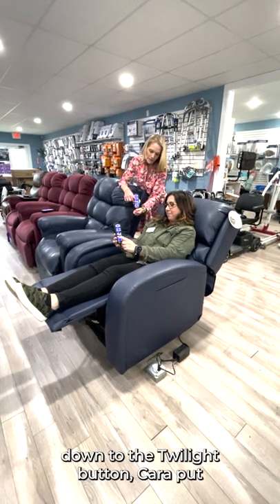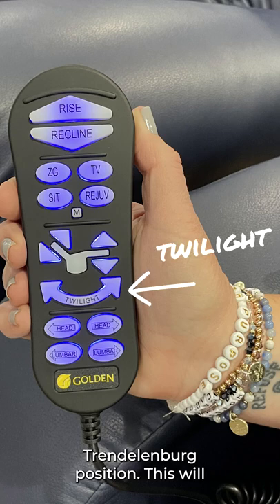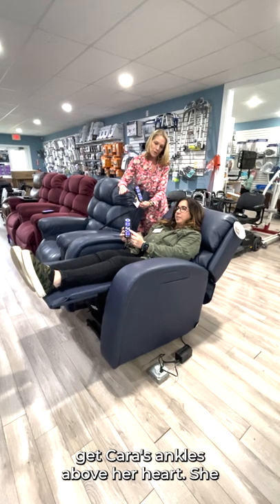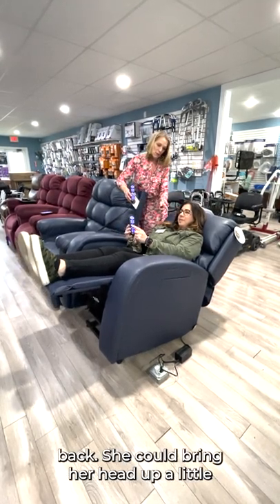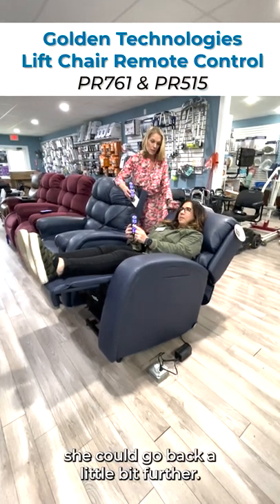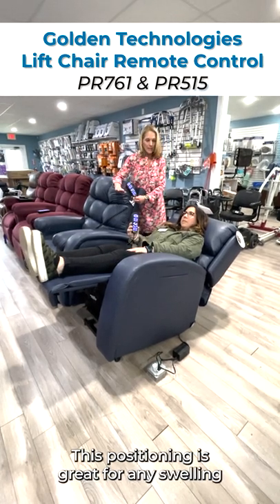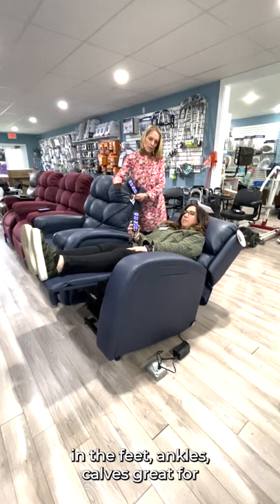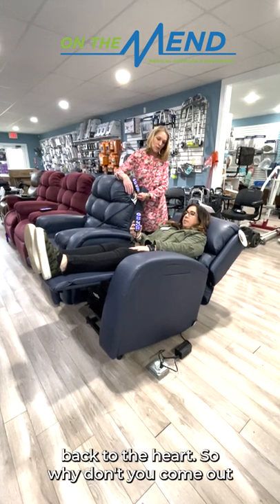Let's move down to the twilight button. Kara, put yourself in the twilight, which is a Trendelenburg position. This will get Kara's ankles above her heart. She doesn't have to have her head all the way back — she could bring her head up a little bit if that was more comfortable, or go back a little bit further. This positioning is great for any swelling in the feet, ankles, calves, great for edema, amazing venous flow, and good blood flow back to the heart.